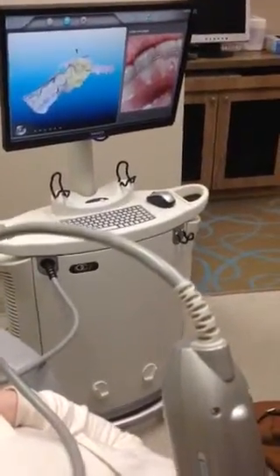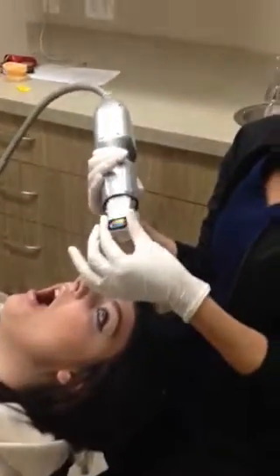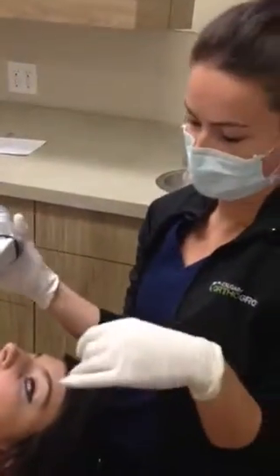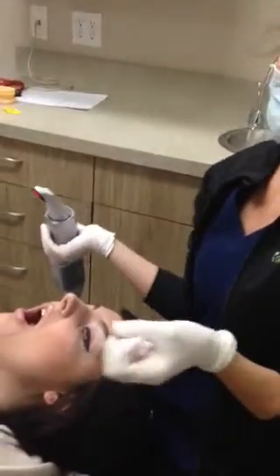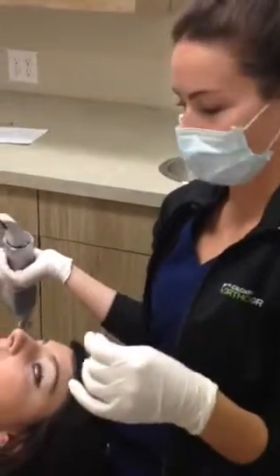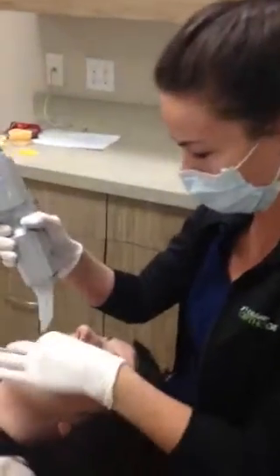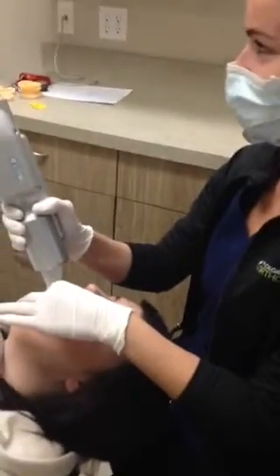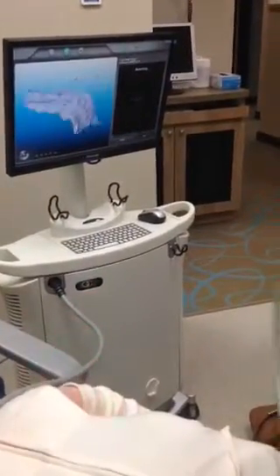Are there any disadvantages to using this machine? Yes, one of them is especially for the little guys. This camera is kind of big, so reaching around the back gets kind of hard for them. Opening their mouth wide for about 8 to 10 minutes is hard for them. Also staying still. This camera is very sensitive to movement, so some little guys like to move around and wiggle, and I'm like, can you stop moving? So that makes sense. Yeah. That's kind of tough, but I think the advantages outweigh the disadvantages for sure.